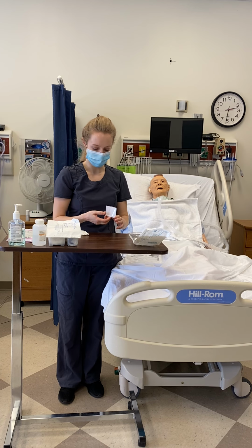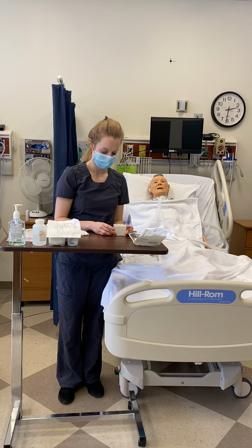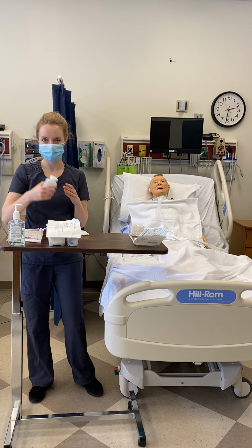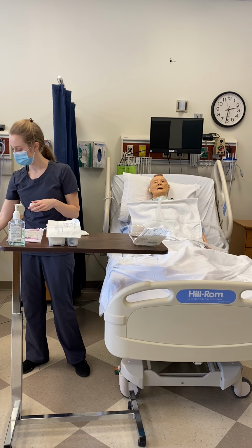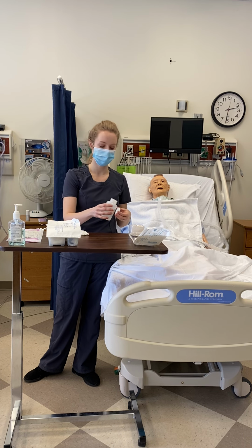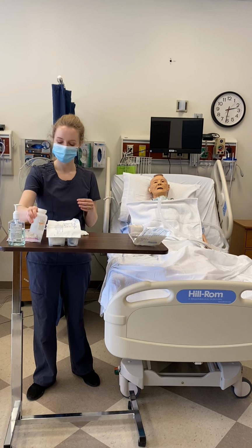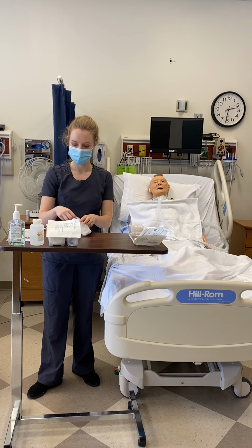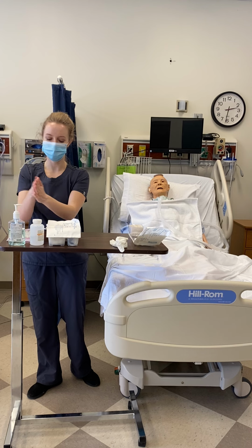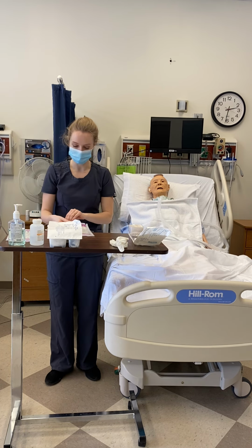container for my saline and put that up right first. And then I take some saline and I'll lip it to ensure that the saline remains sterile, and put some in my container. Next, I will perform hand hygiene. And now I put on my sterile gloves.